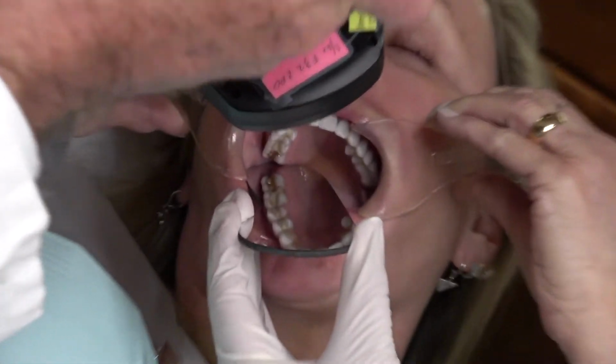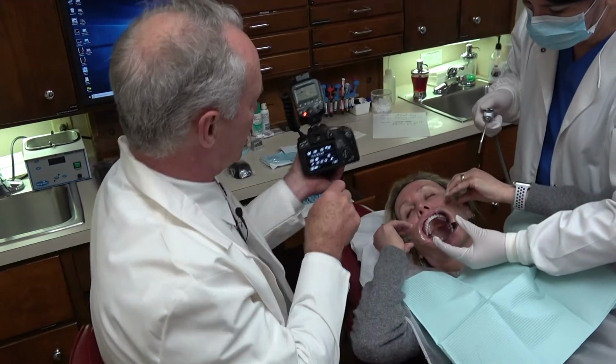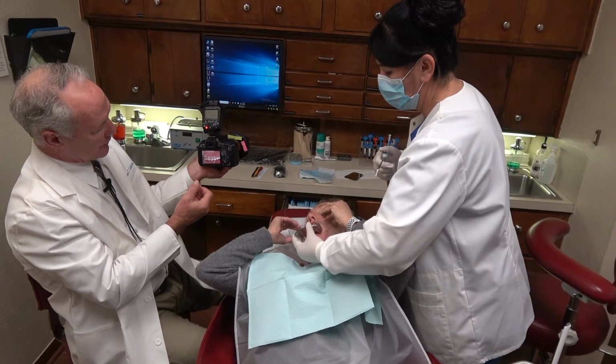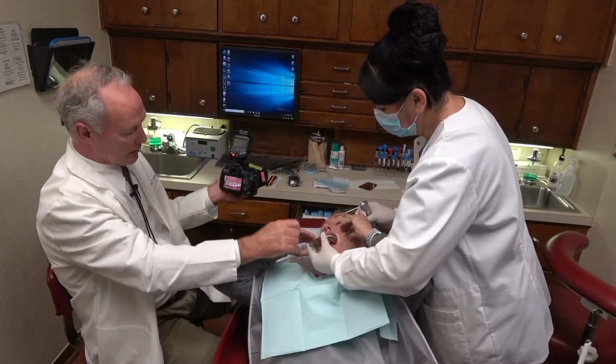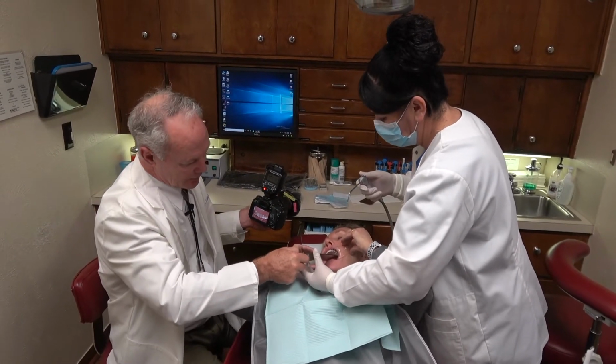Now when you take this view, you want to take it straight on, not at an angle. So if the teeth have cracks or there's leakage around fillings, you can see that. You don't want to take an angled view. You want to get the mirror so that you're taking a view straight on at a right angle.